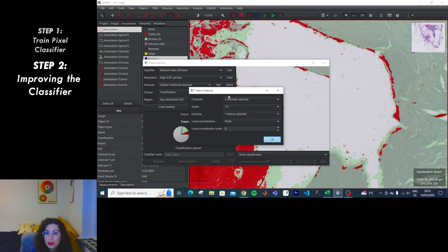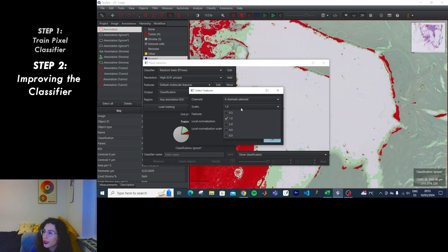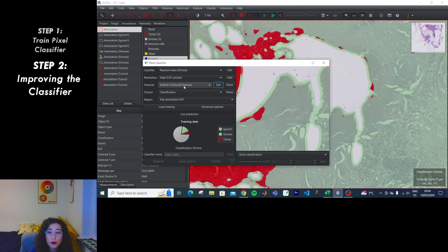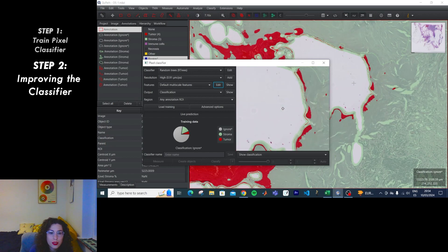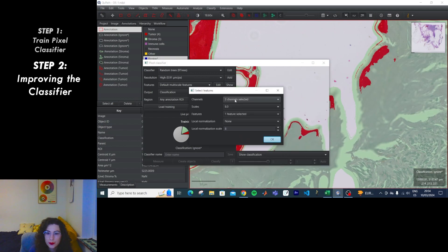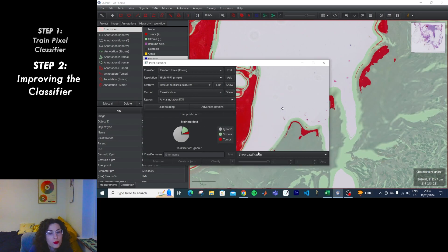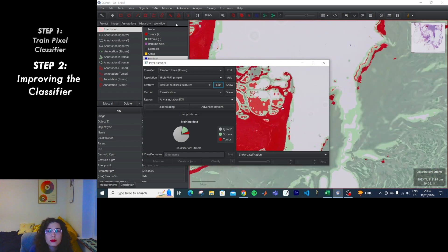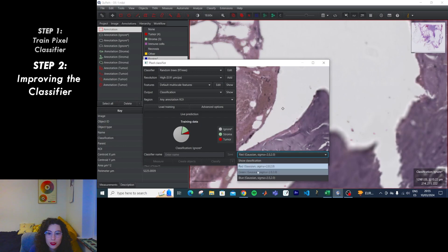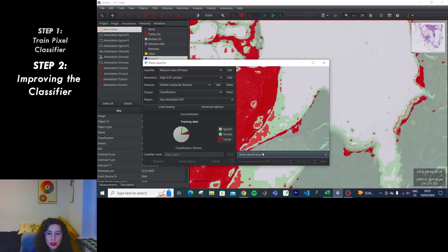We can also customize the features. Edit — three channels. What if I choose all the channels? Scales — what are scales? Different amounts of smoothing. What if I do a lot of it? That helps with background — but what helped: the inclusion of more channels or the smoothing? Let's see. But then I get fat borders, which are not ideal. So we don't need more channels — maybe just two. There are so many features. This shows us the available images it's using for the classification.